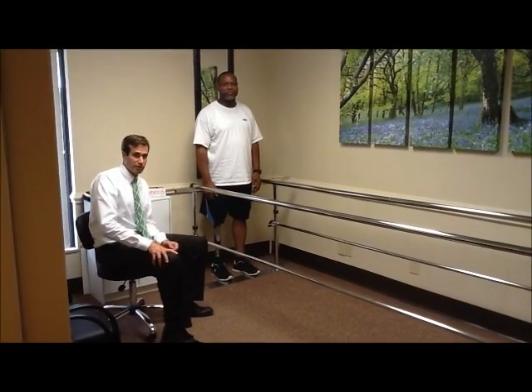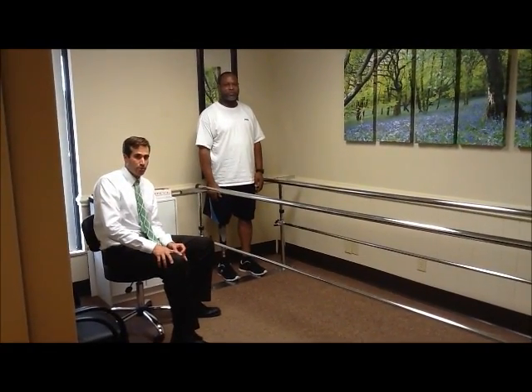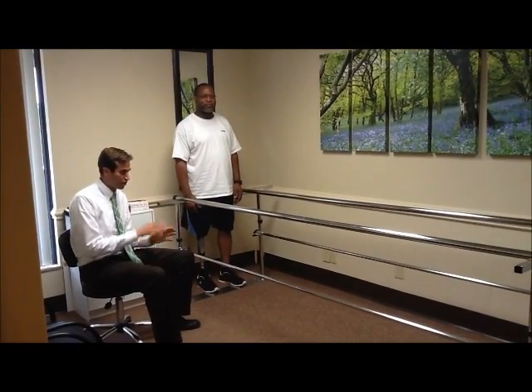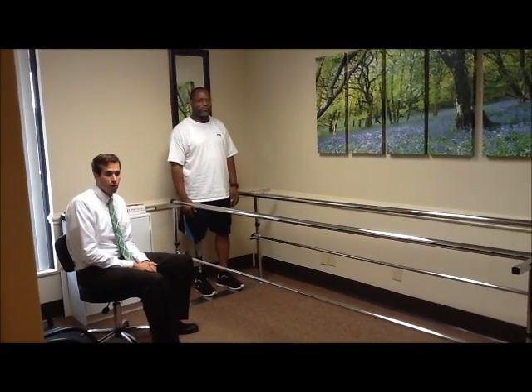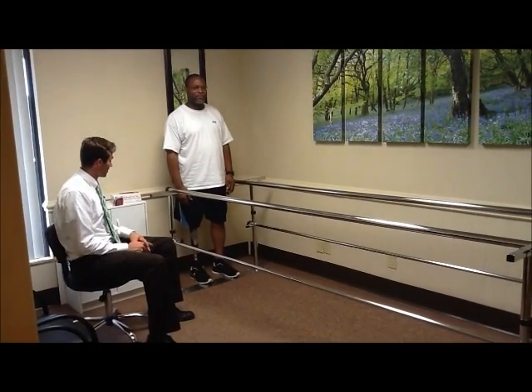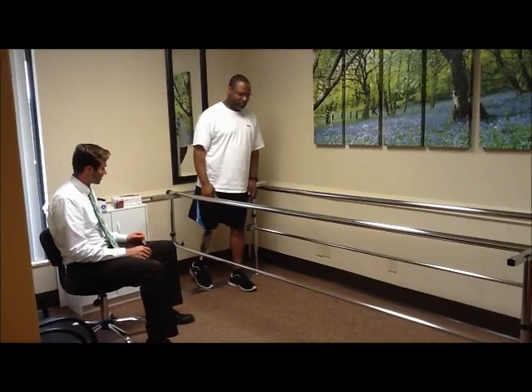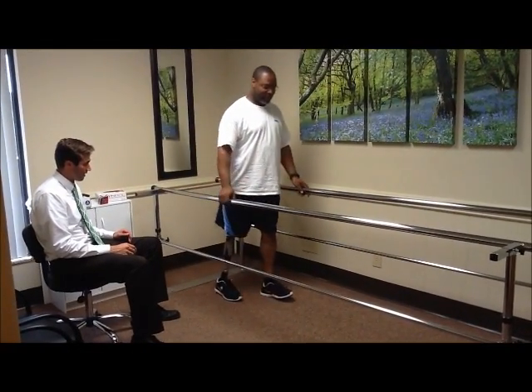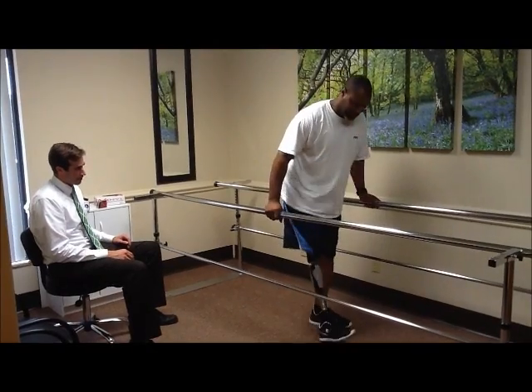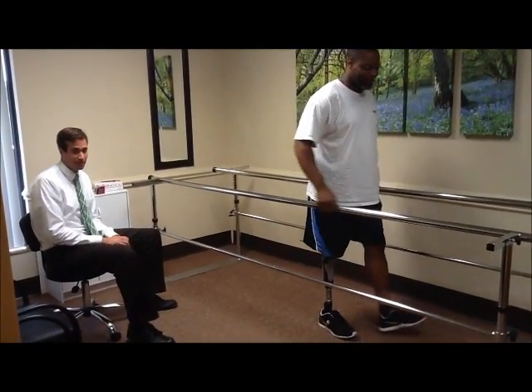One of the first things we'll demonstrate is the stumble recovery. Robert will take a step and show you what would happen if by chance you caught the toe or you didn't completely lock the knee before putting weight on it. We'll show how the knee provides some resistance — hold the bars so we don't have a fall. If you were to catch the toe there, you can quickly catch your balance.